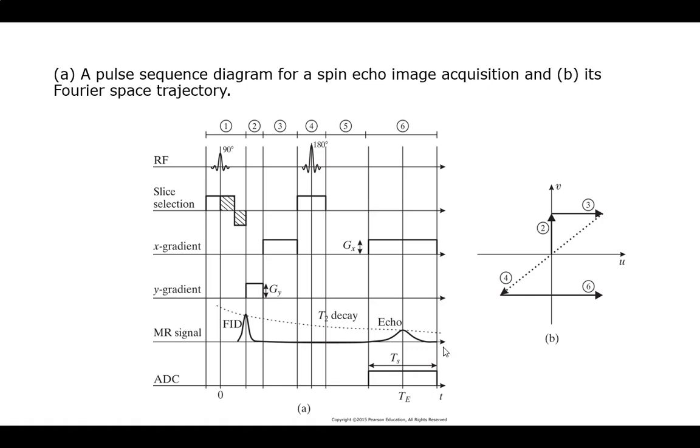If there was no echo and you could just directly read FID, you would only have to do the upper part of this. So this is almost kind of like backing a trailer up versus driving a car. Right? When you're backing a trailer up, you have to kind of do some reverse because the other end is going to drive a little different.